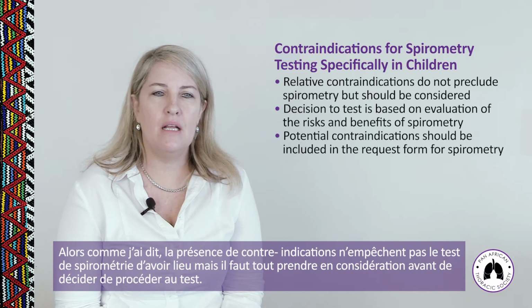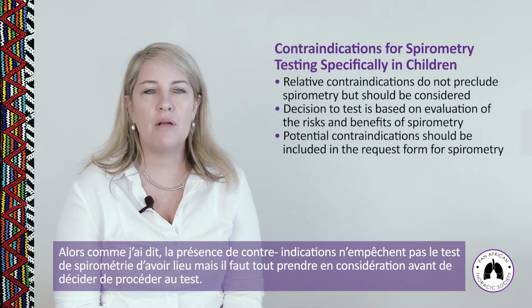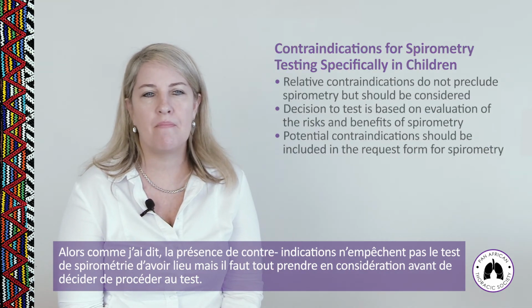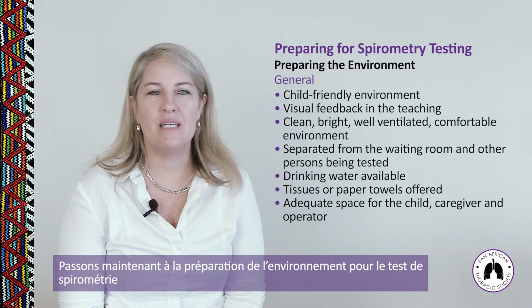So as I said, the relative contraindications do not preclude that the test be done, but you just got to take all of it into consideration when deciding to go ahead and test that patient. Right, let's go on to preparing the environment for the spirometry test.